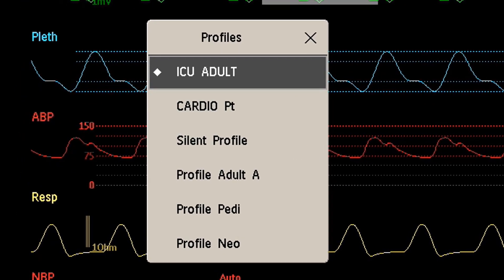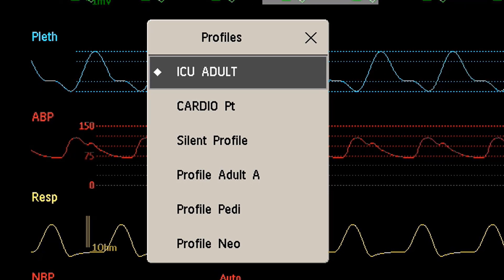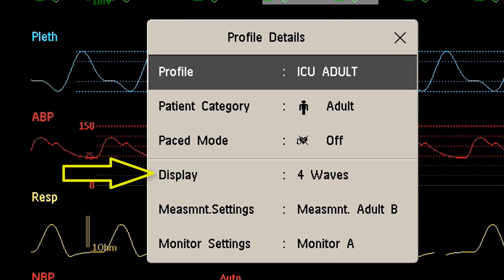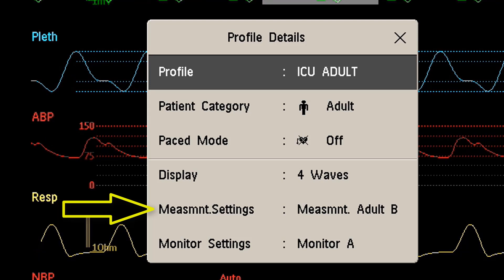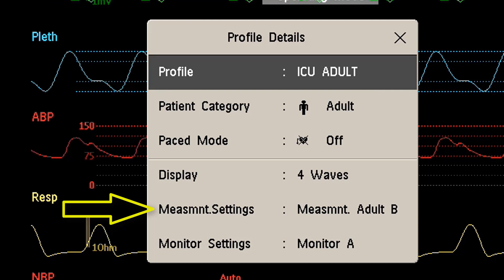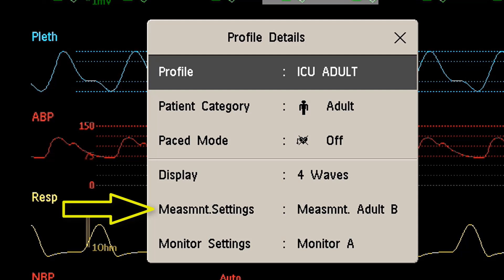A profile groups three categories of settings. The first category is the default screen layout that is linked to the profile. The second category is the measurement settings. These relate directly to individual measurements — for example, if a measurement is by default switched on or off, the color of the measurement, what are the default alarm limits, or what is the unit of measure for the measurement.